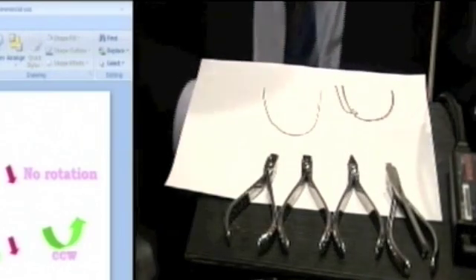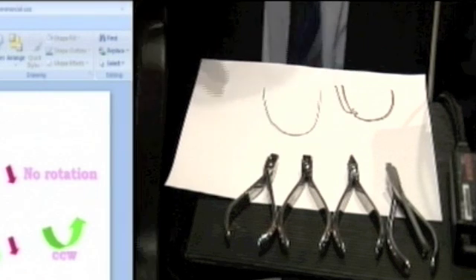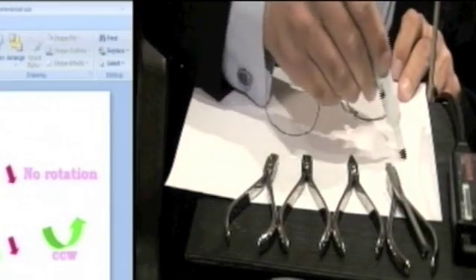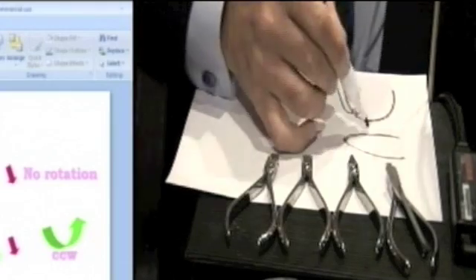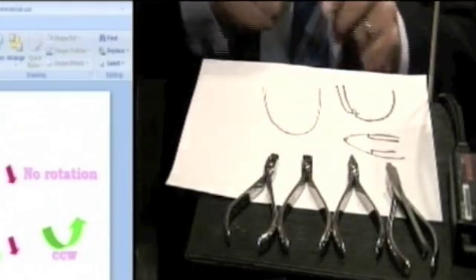So let's just say my bracket position is too gingival or too incisal. I don't want to reposition. On TMA, I can use the same wire but now the wire's like that. And I can do a step up or a step down. So let's use the same wire.